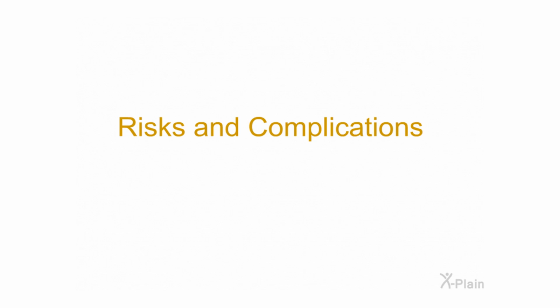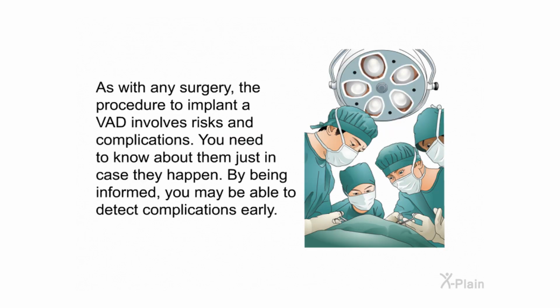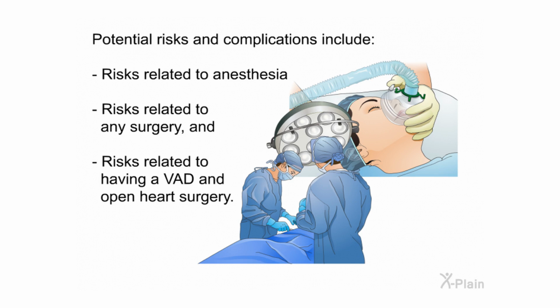Risks and complications. As with any surgery, the procedure to implant a VAD involves risks and complications. You need to know about them just in case they happen. By being informed, you may be able to detect complications early. Potential risks and complications include risks related to anesthesia, risks related to any surgery, and risks related to having a VAD and open heart surgery.